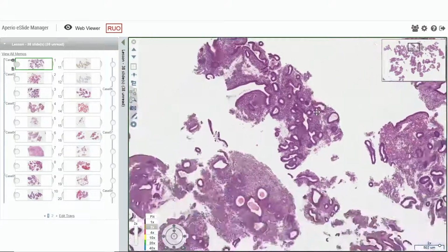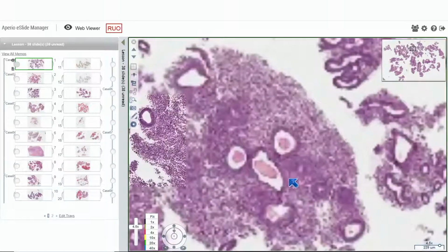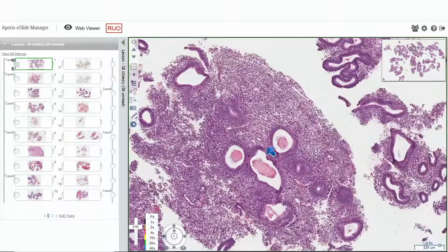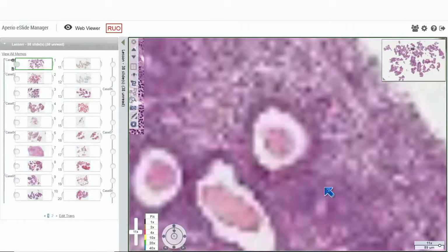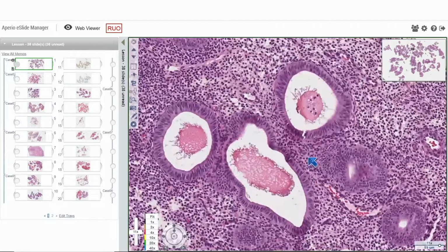And one of the very first changes that you'll see in the endometrium that's seeing too much estrogen, this kind of looks like two eyes and a big nose, doesn't it? Is you'll see proliferation, mitoses, and then you'll start to see cystification of the glands. And we think of this as a disordered proliferative or persistent proliferative endometrium.